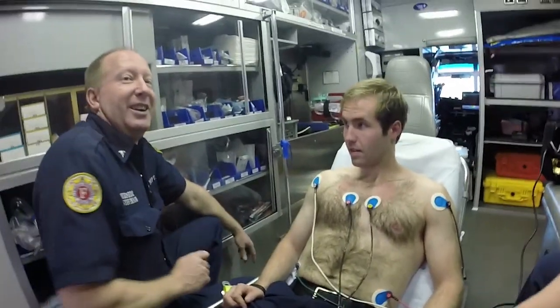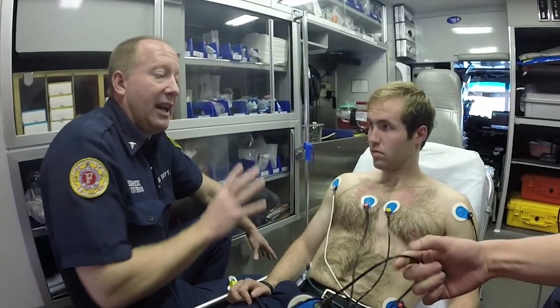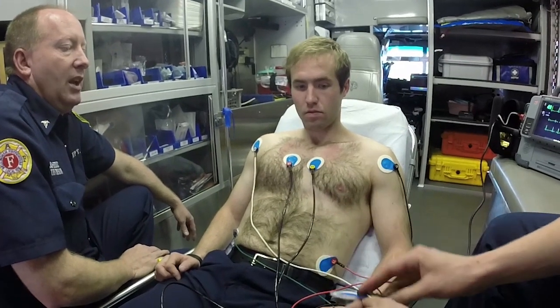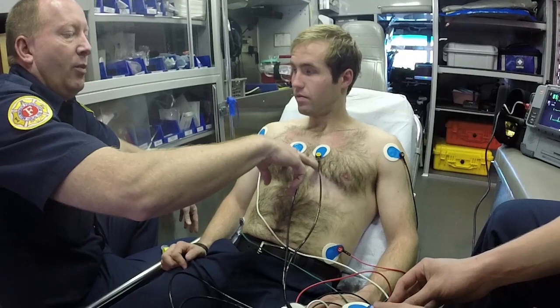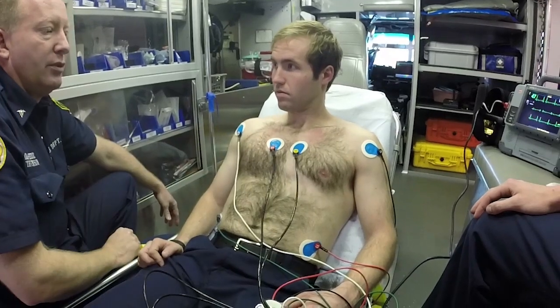It doesn't have to be perfect. As we do these, I think you can get too keyed up on making it perfect — it doesn't have to be perfect, it has to be close though. We want to be relatively close, but this will definitely get you there. If you ever think when you're putting these on that they're even with the nipple line, then you're wrong. They're supposed to be a little bit above the nipple line as far as the first two, V1 and V2.